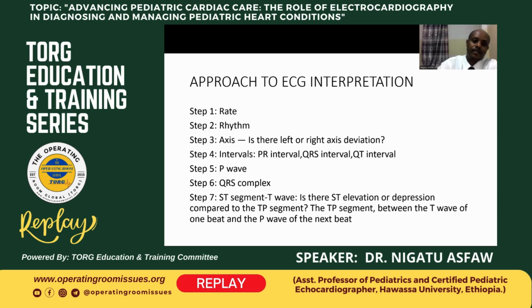The other method is that we can additionally use lead 2 in order to determine the axis. And the third method is to use the isoelectric line, and then we can use the most positive limb lead in order to determine the axis, which will be 90 degrees to the isoelectric limb lead.